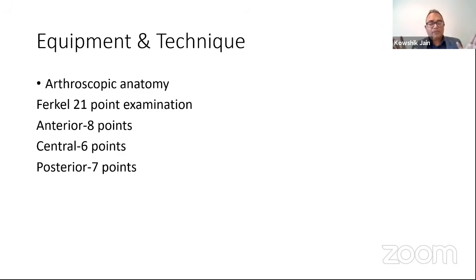But your aim is to do a thorough examination of the medial gutter, deltoid, lateral ligaments, the anterior gutter, and the articular surfaces of talus and tibia. Not to forget the syndesmosis, which can be very thoroughly examined using an anterior ankle scope.